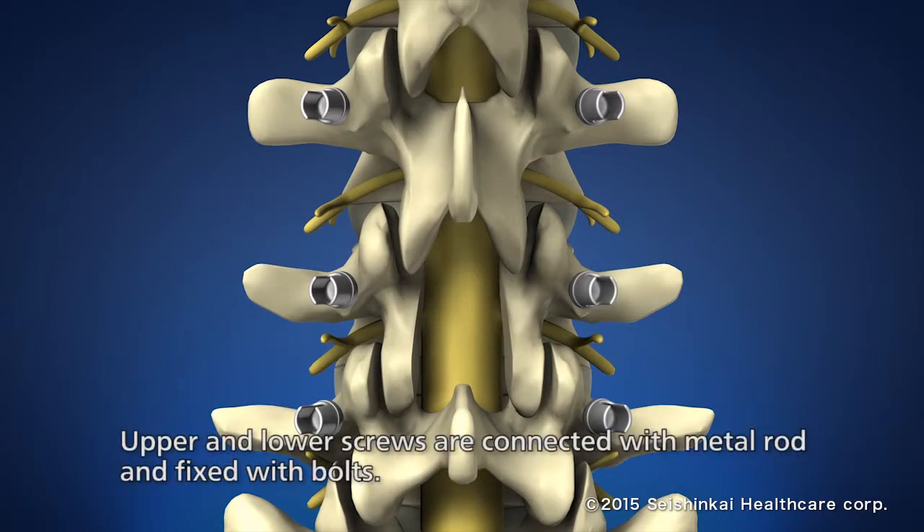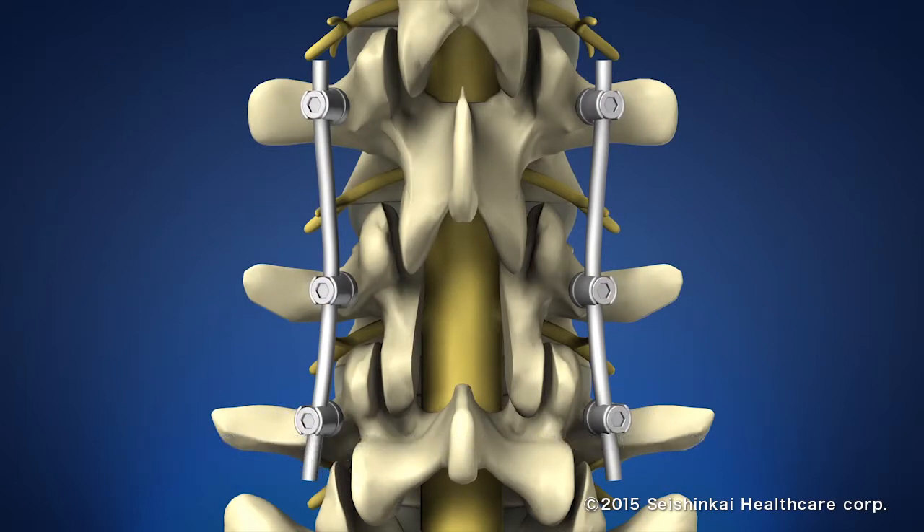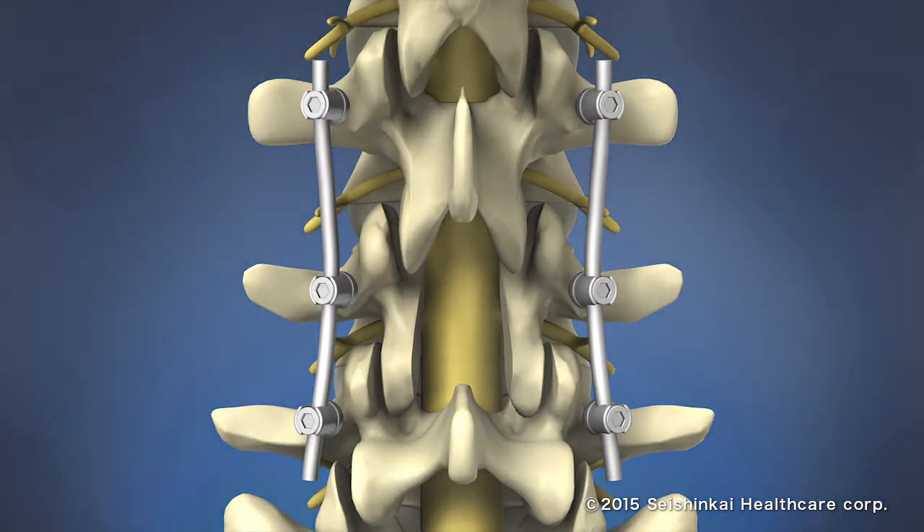The up and down screws are connected with a metal rod and fixed with bolts afterwards. If stronger bone adhesion is needed, a piece of bone from the patient or artificial bone may be transplanted.